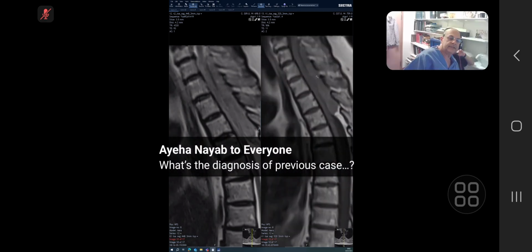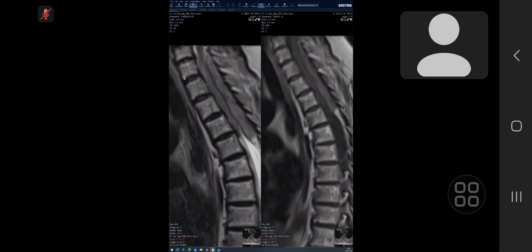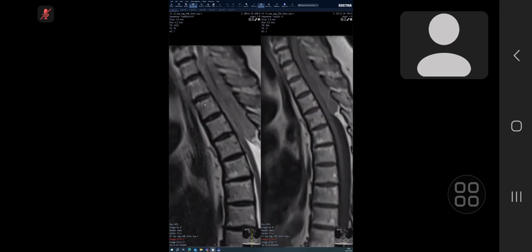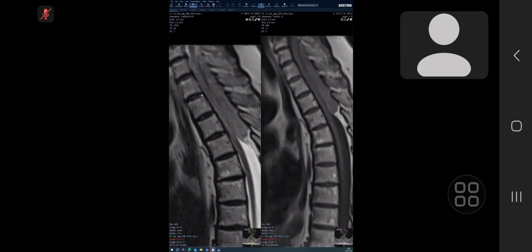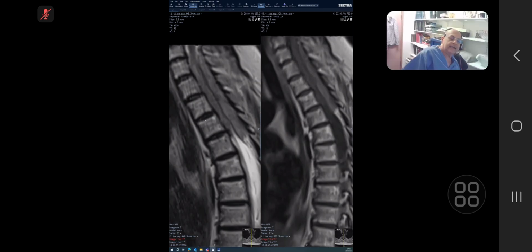Okay, so this lesion is magnified. Is it arising from the bone? No, sir, it's not arising from the bone. It's an extramedullary lesion, an intradural extramedullary lesion. So where do you think the dural lining is, so that everyone is clear about it?